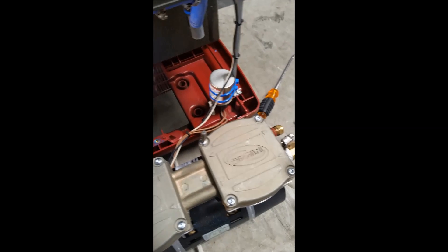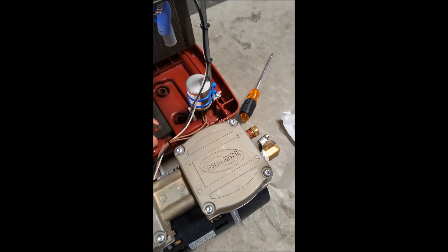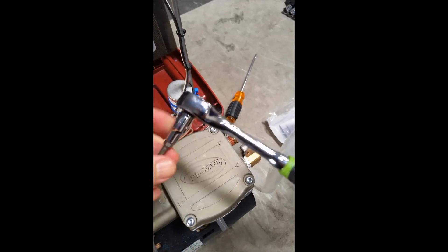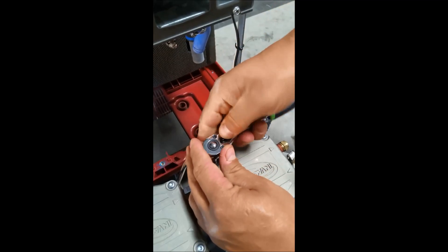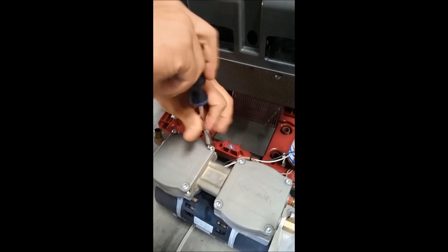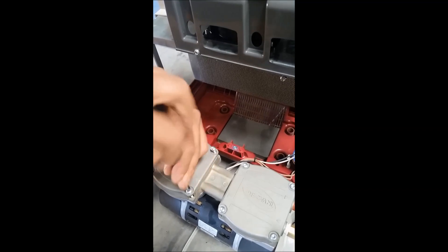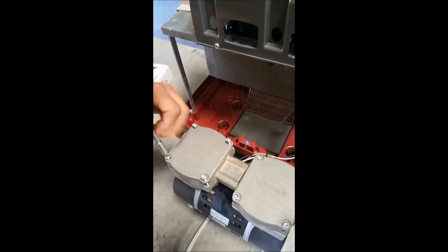The screws at the top of the compressor need to be removed. These require using the proper style screw — just look for your socket set and find what's appropriate. After you've loosened all the screws with your socket set, you can switch over to your screwdriver to go faster. You can see after loosening, it's quite fast.